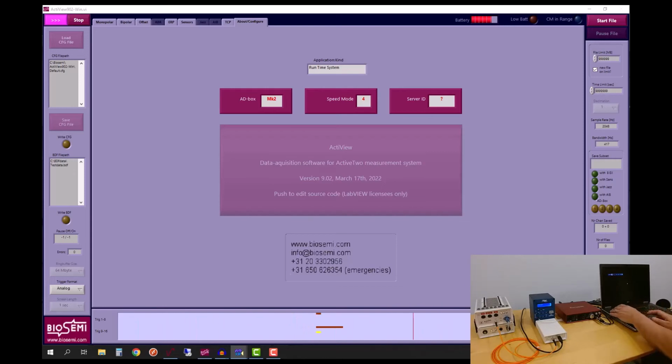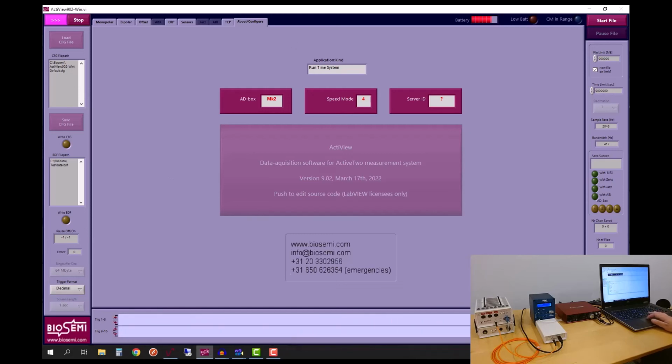And let's try changing the format to decimal so that you can interpret those codes as numbers, as we had seen it before. So on the top you see 1 and a 0 below it.